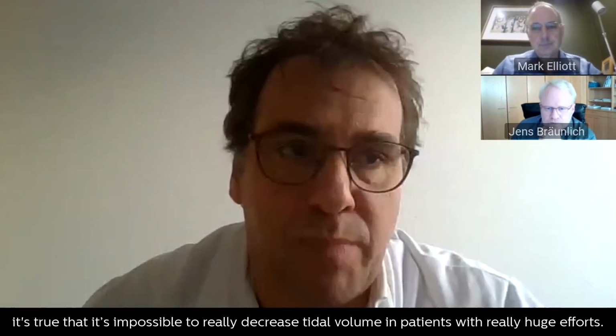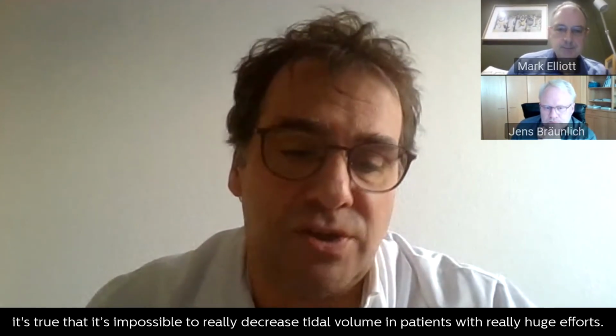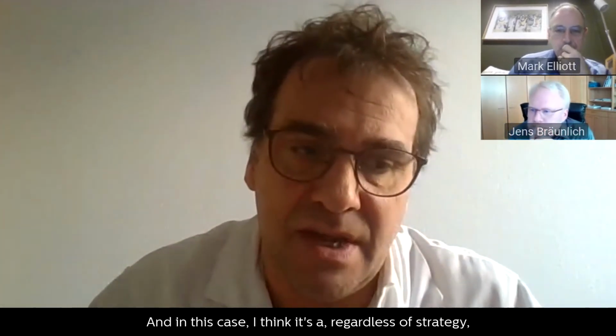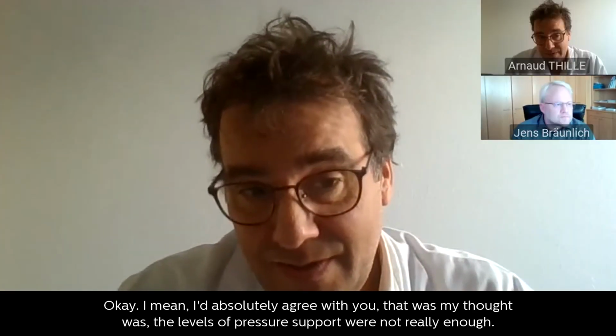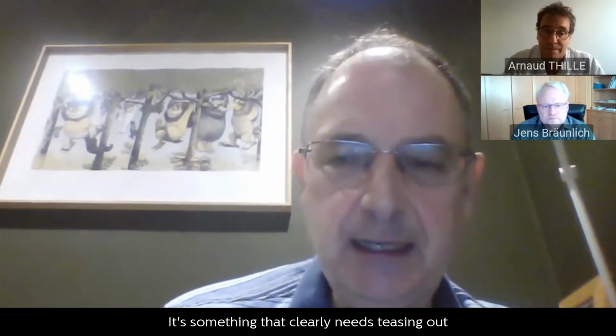But it's true that it's not possible to really decrease tidal volume in patients with really huge efforts. And in this case, I think regardless of strategy, it's impossible to limit the tidal volume. Okay, I absolutely agree with you. That was my thought, that the levels of pressure support were not really enough. It's something that clearly needs teasing out.